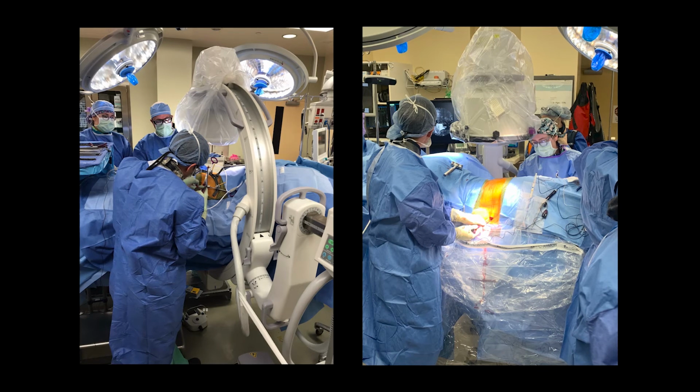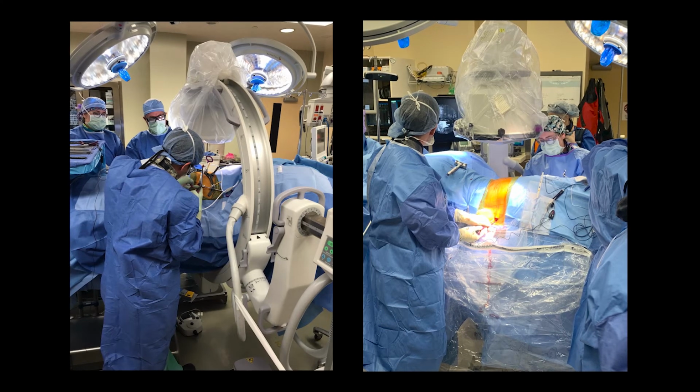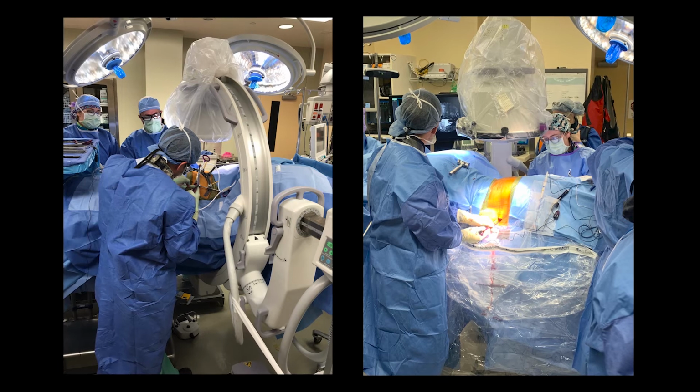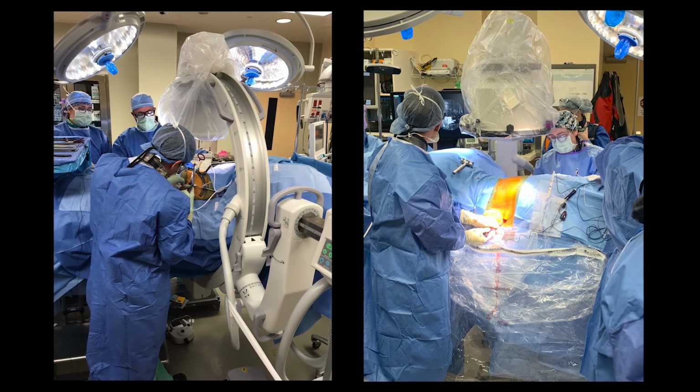Here are some intraoperative pictures. On the left, you see me working with the patient right side up with the XLIF retractor, working in a standard XLIF case. And then on the right, you see I'm putting the screws in. If you look closely, my assistant is on the other side of the patient, still closing the abdominal wound. So not only do you save time by not flipping prone by doing single position surgery, you can also work on the front and the back of the patient at the same time. And so I can get the screws in before that abdominal incision is even closed.